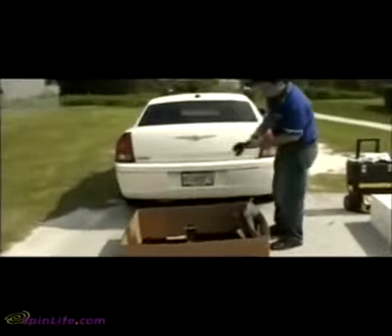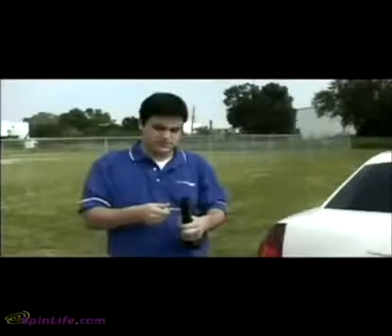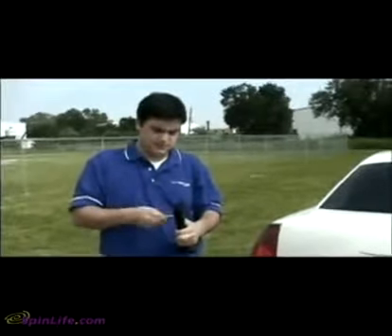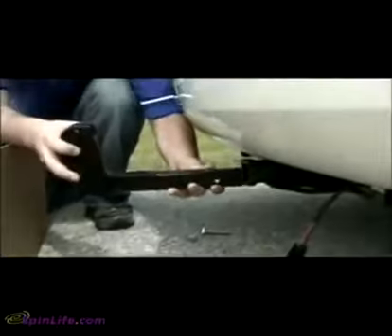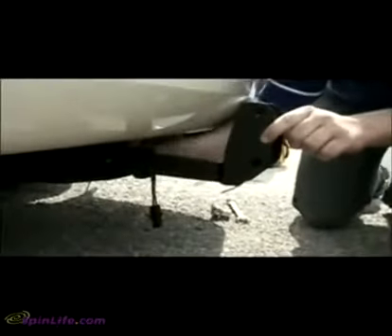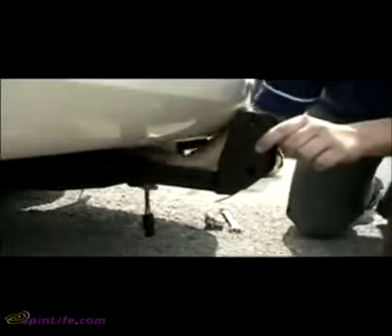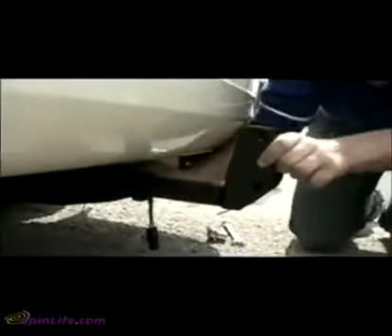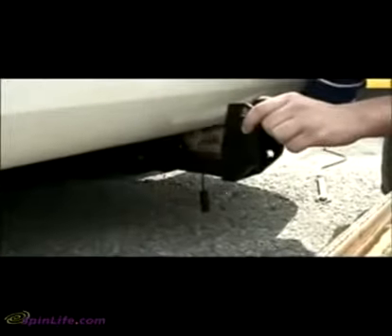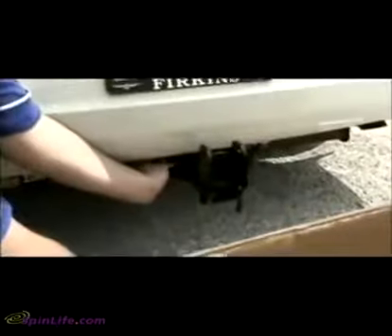Locate the hitch adapter inside the box. This video shows a Class 2 hitch adapter with a single threaded hole. Your hitch adapter may vary depending on the application. Remove the bolt from the hitch adapter and slide the adapter into the vehicle's hitch receiver. The hitch adapter may be positioned pointing up or down depending on the distance from the bottom of the hitch receiver to the ground. For proper lift operation, it is important to ensure that the vehicle hitch is level to the ground. Tighten the bolt and add a locking nut to secure.